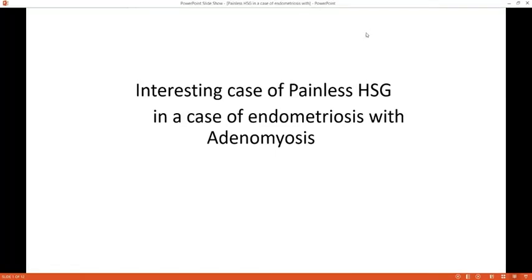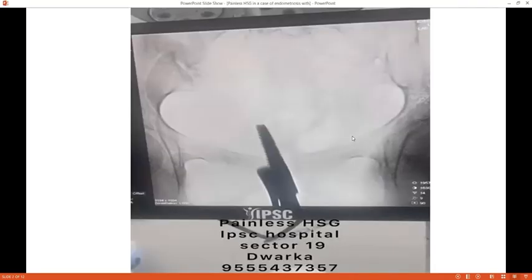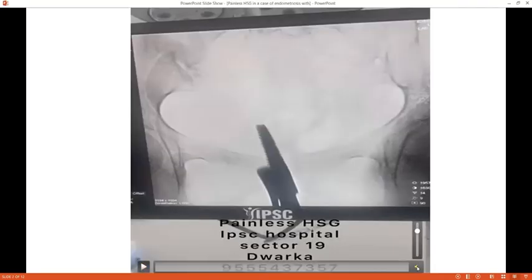Hello everyone. I'm sharing with you an interesting case of painless HSG in a case of endometriosis with adenomyosis. So the patient had come for HSG to check the patency of the tubes, and here I'm sharing the video of the HSG, and here you can see the video.